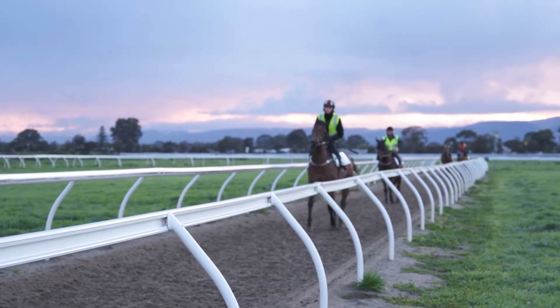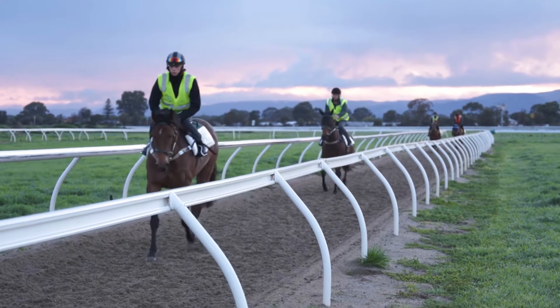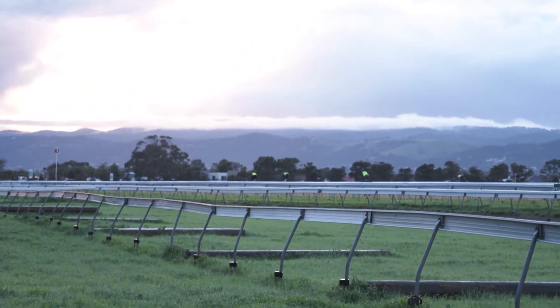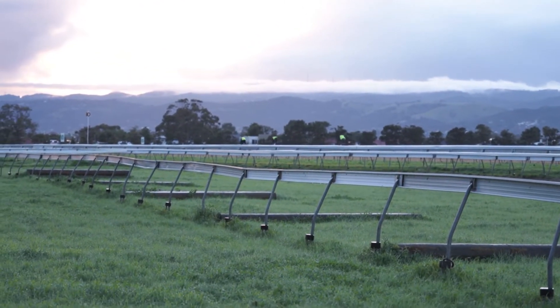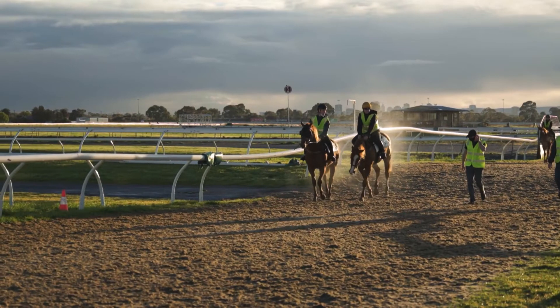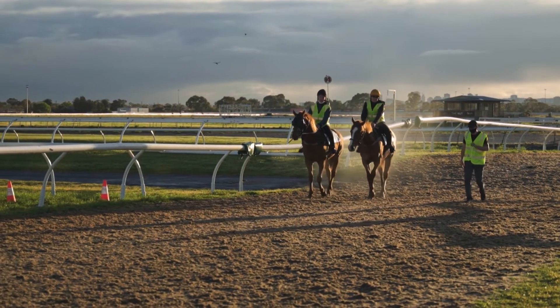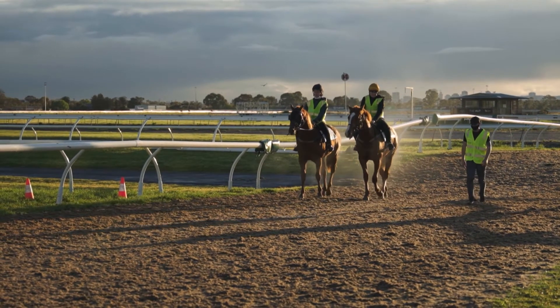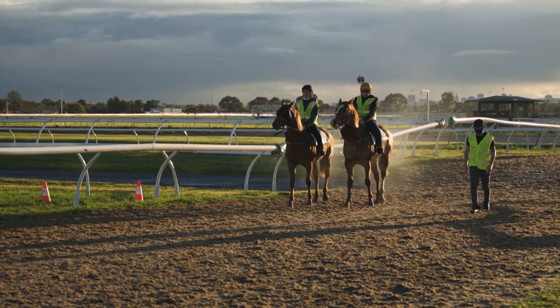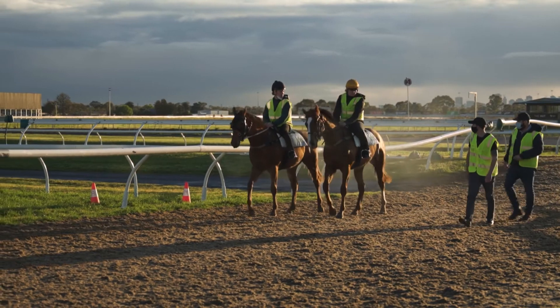The beauty about having the tracker on for a set piece of work like this is the horses are going out to do a very regimented piece of work and it's important that the riders maintain the right speed at the furlong. The tracker, when we get the data back, will tell us how fast they've gone for each furlong, whether they've gone too quickly or too slowly. We can then match that to the horse's recovery and, in the next session, alter its training regime accordingly.